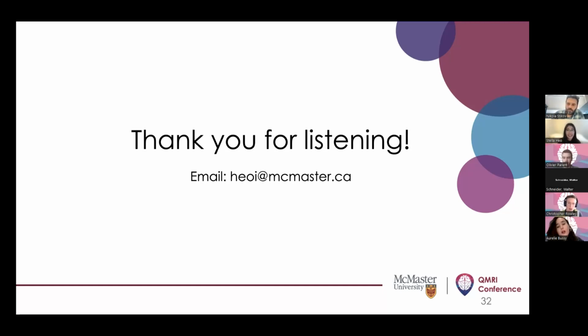Thank you. I can add a quick comment to that as well, just because I've seen the data. What we're looking at now is potentially using the noise in the background as the scaling factor. It didn't seem like we had similar instructions in terms of holding the gain factor constant, so we're not sure if the gain factor is changing between images. It might not be. We're certainly hoping it's not. But between sites, there's a definite difference if we just look at the histograms of the noise between the high contrast T1 and the proton density weighted image.